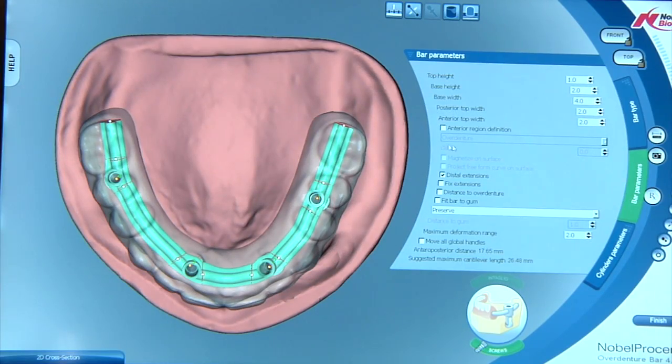This is the first new feature. It's called the anterior region definition. By clicking on this, what it's going to allow us to do is place different types of support mechanism along the top surface of this bar.